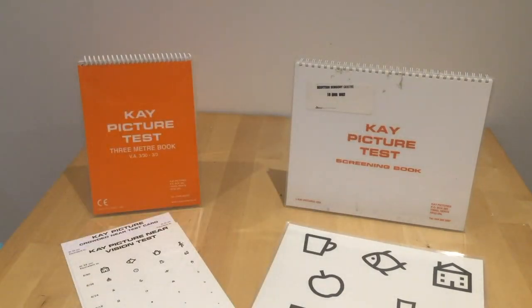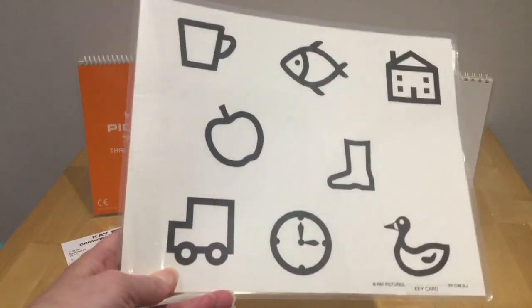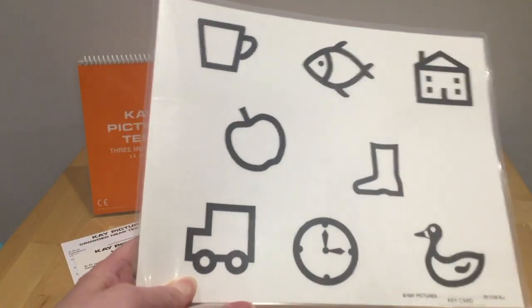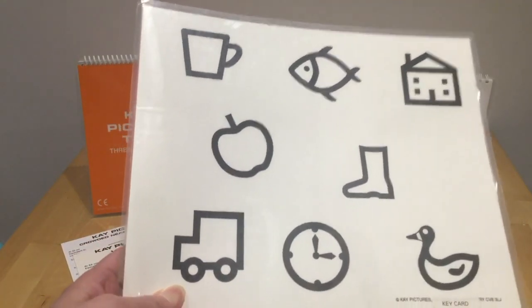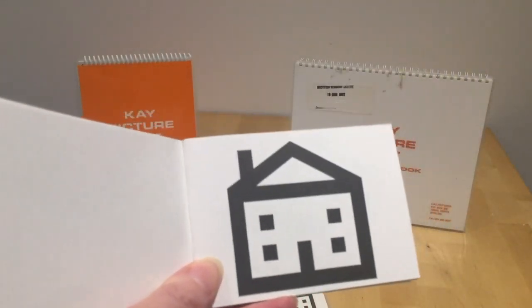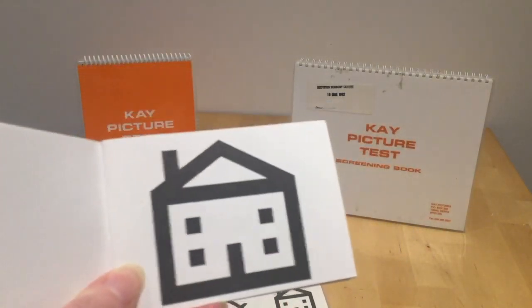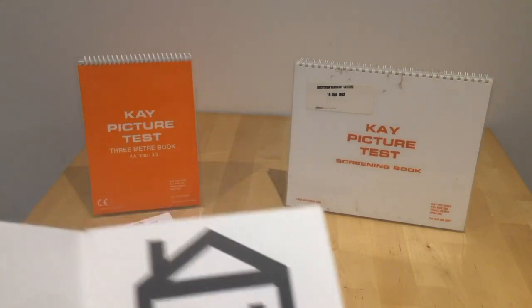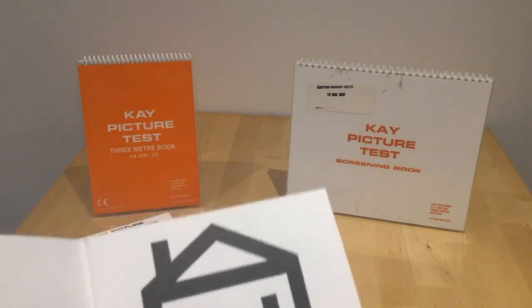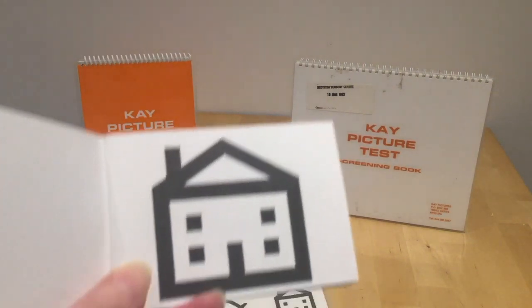And you can use this in conjunction with this key card, which can be used throughout the assessment. So with the key card or with this recognition book alone, you would ask the child to name the picture or to match it to the key card. Now it should be noticed that there are more pictures in the recognition book than there are on the key card.